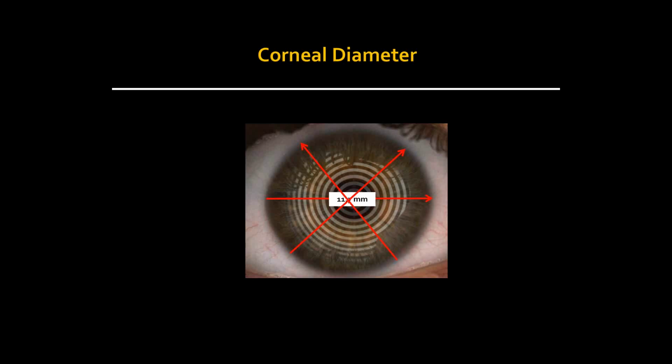Clinically, to truly report on HVID, you don't always have the ability to do so. Depending on the instrument you use, you can also do so with very simple tools you have in your office, but you can get a good idea of HVID if you're taking topography at the same time. It doesn't take any additional time. As long as you apply the calipers, you can get an idea of that eye shape.